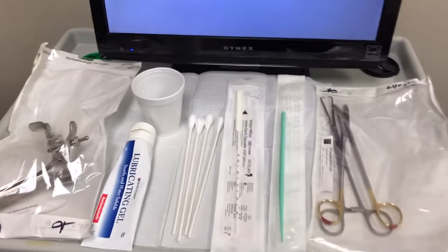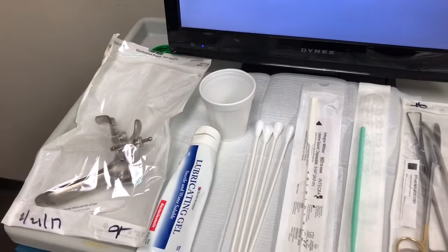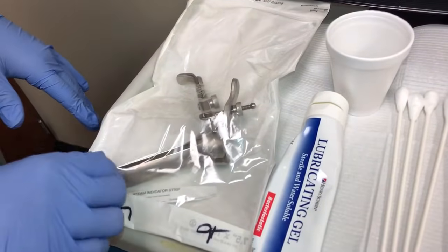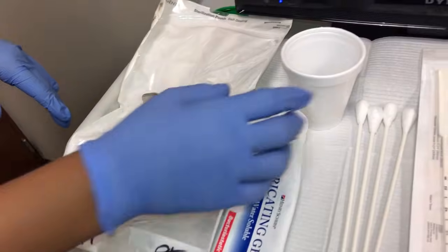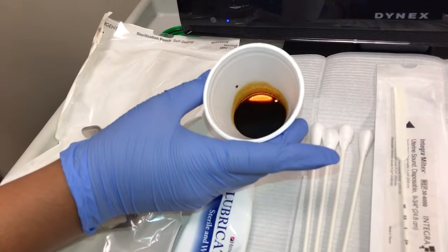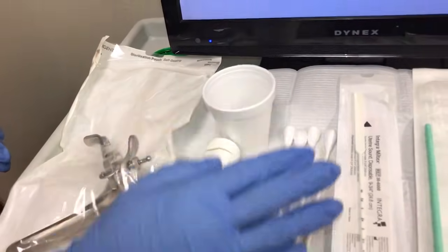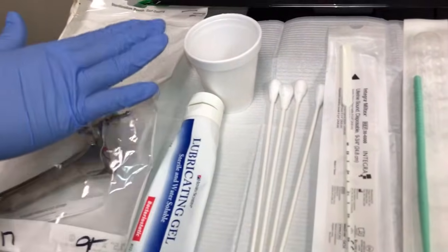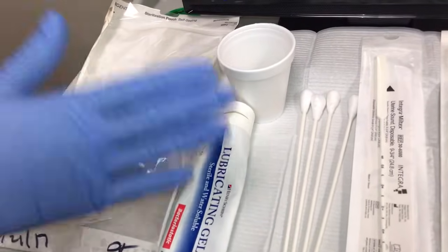Today we are going to be filming an IUD insertion. These are the supplies that we'll be using, starting with the metal speculum. In this cup we have the betadine solution, which is used to sterilize the cervix as much as possible. We have our OBGYN swabs here, which go into the betadine solution and then onto the cervix.